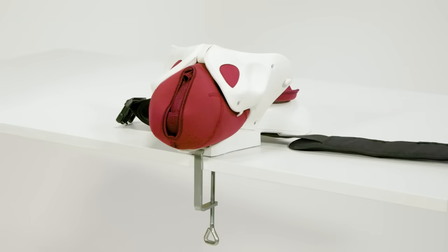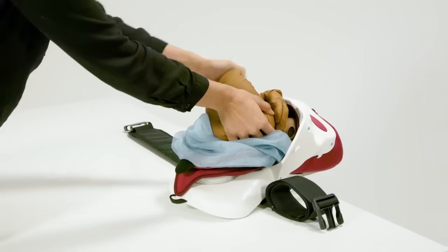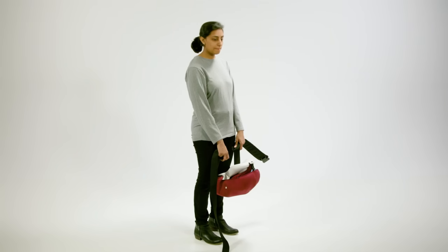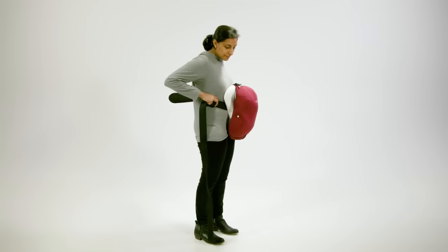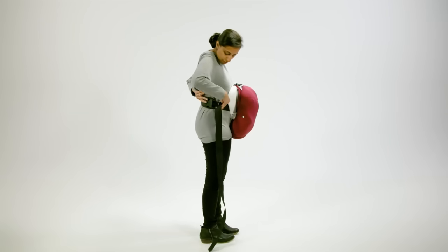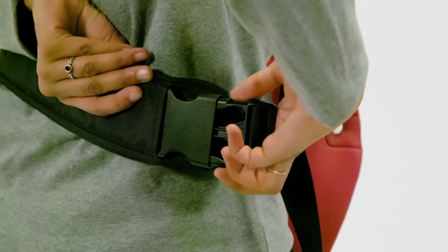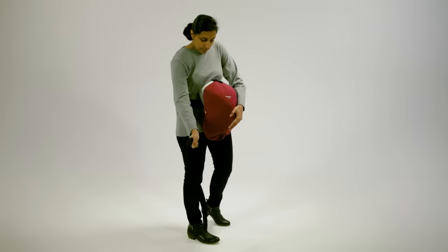Mama Berthi can be used on a tabletop to demonstrate skills, but it's most effective when worn by a facilitator for simulation. Hold Mama Berthi on your front and wrap the belt around your back. Connect the clasp and tighten the belt.